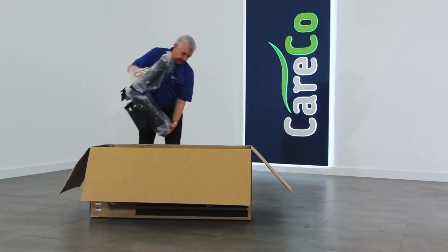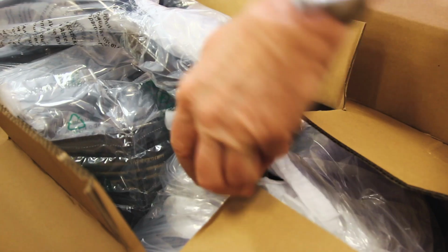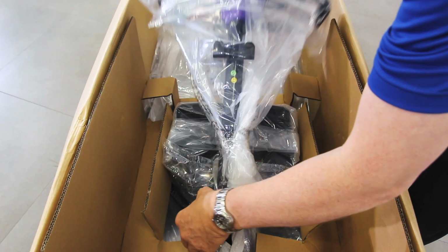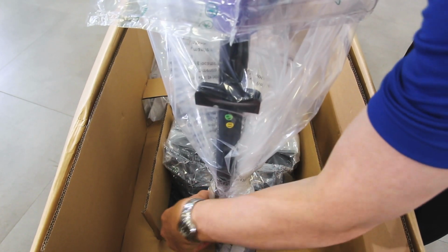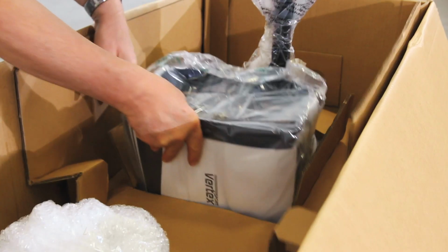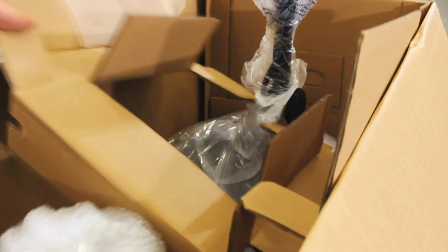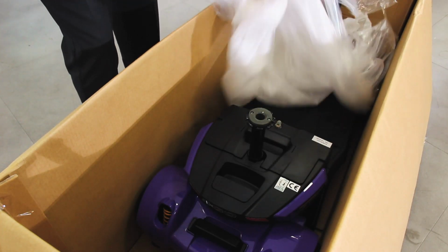First, lift out the seat and set it to one side. Then remove the armrests. Twist this dial on the front of the scooter to unlock the tiller. Raise the tiller, then twist the dial again to lock the component in an upright position. You can now access the front basket and remove the excess cardboard packaging. Cut off and remove the cellophane wrapping.